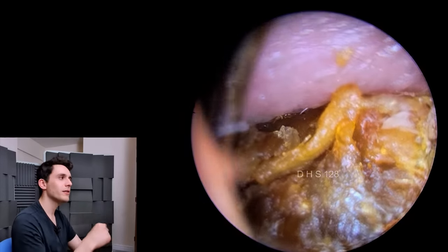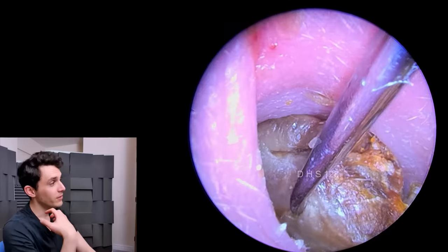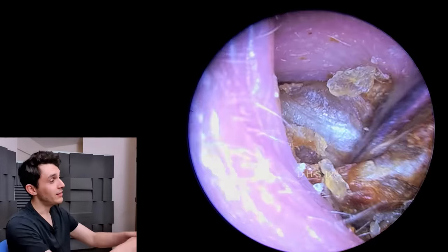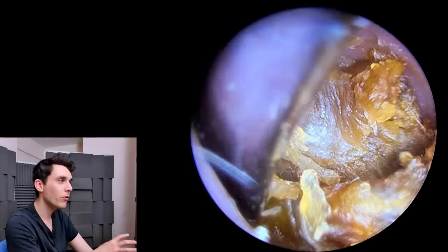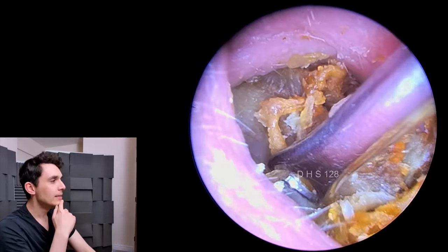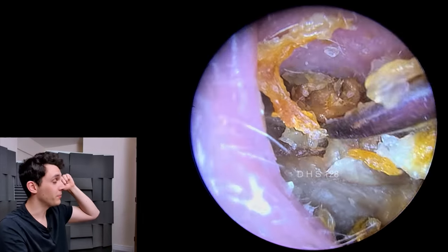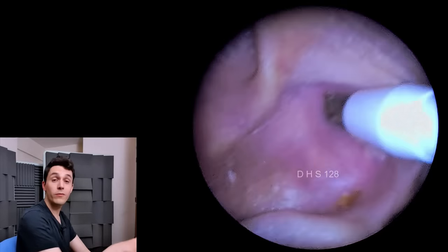This is a Formby scoop — I think I've shown this only once before. A Formby scoop is just a very large Jobson horn, a very large metal smooth Jobson horn. As you can see, it's just impractically large — almost way too large for 99% of cases. I thought I might get away with it here and just yank this plug out quickly. But as you can see, I'm just pushing it in further — I'm disturbing the plug but ultimately undoing the work I did. This is the problem with a lot of tools on the market.